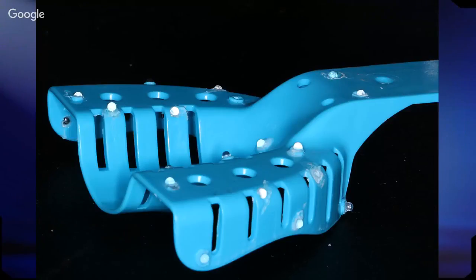It's important to keep the beads away from the line of scatter. What does that mean? You notice that we try to keep them down by the rim and on the top of the tray where the occlusal surfaces are, and even going into the handle. These beads are radiographic markers that are going to be used to align the scan to the patient's jaw in the Blue Sky software. So by gluing these in, you want to put a lot of them. We usually put about 12 on every tray. This is because some of them are going to get wiped out by the X-ray scatter. That's just going to happen. So the more you have, the more points, the better.